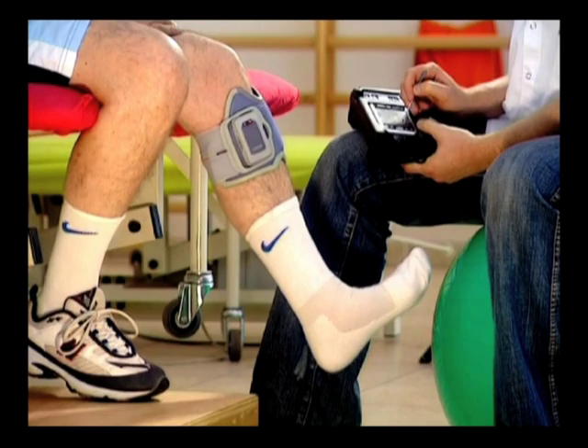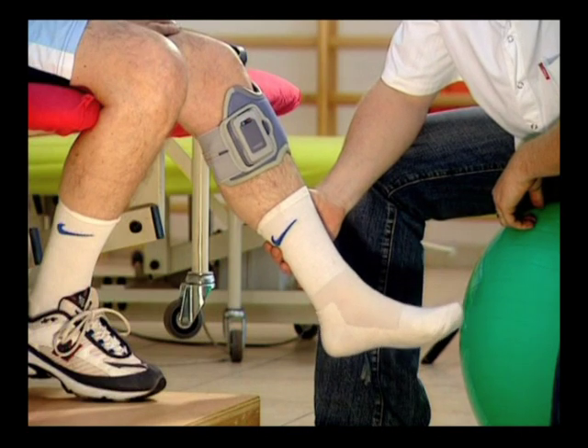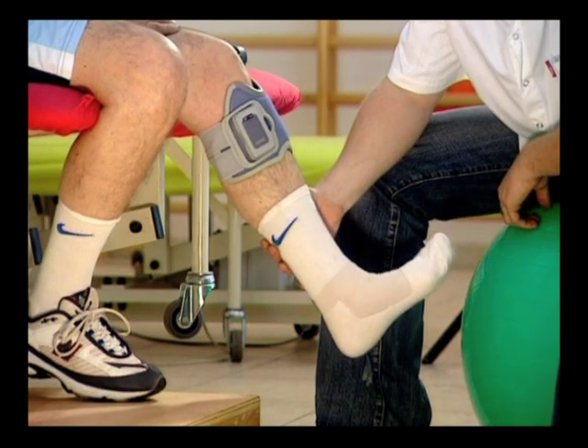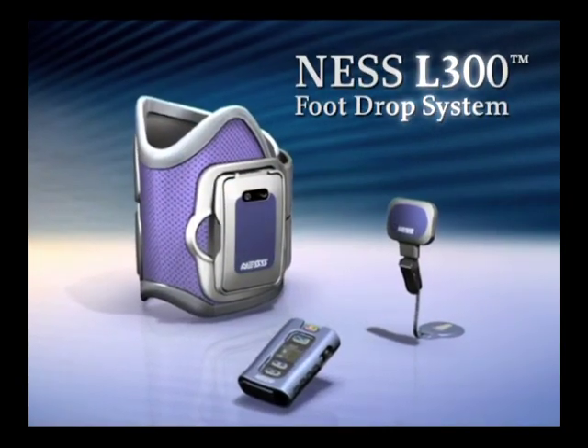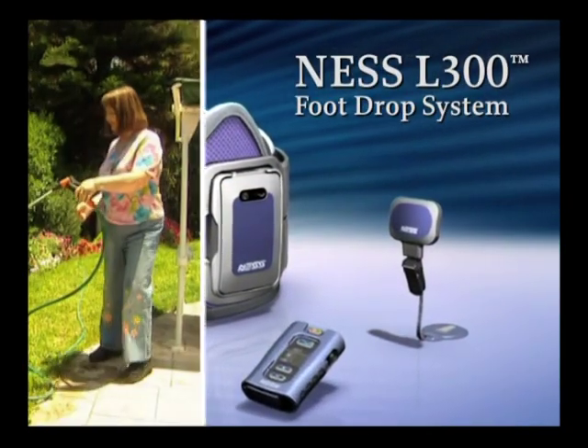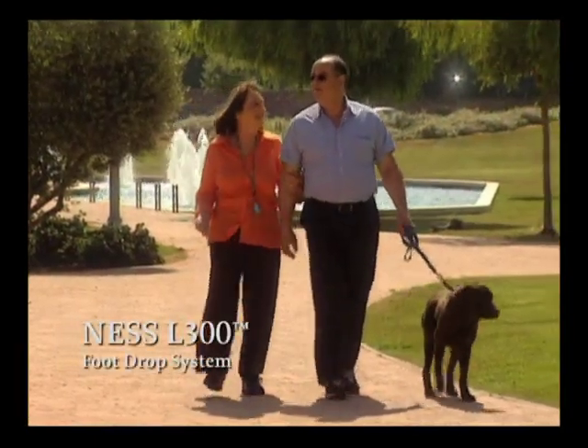By providing dorsiflexion of the foot, the Ness L300 may improve an individual's gait — a manner of walking — and may facilitate muscle re-education, reduce atrophy, and increase joint range of motion and local blood flow. The Ness L300: where cutting-edge medical technology and modern rehabilitation meet to promote independence and quality of life.